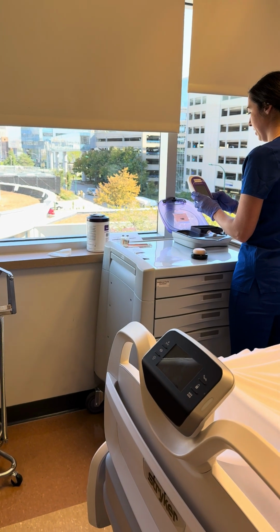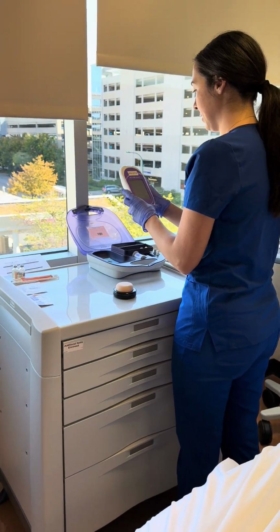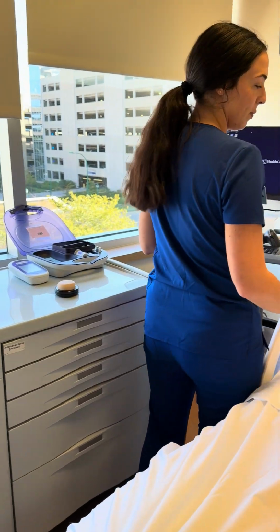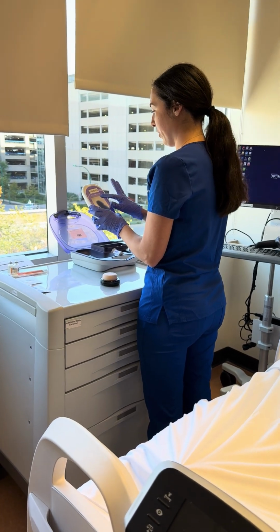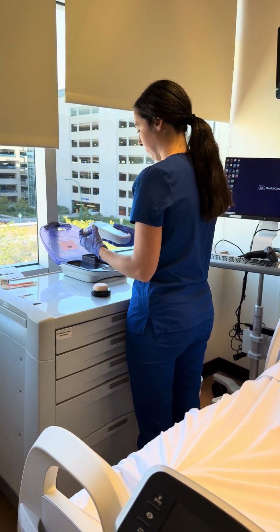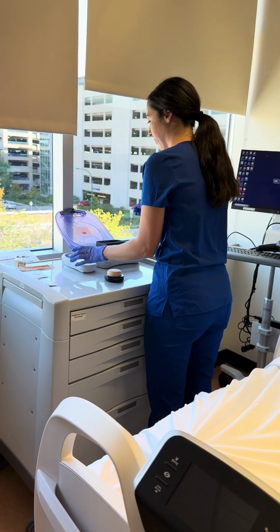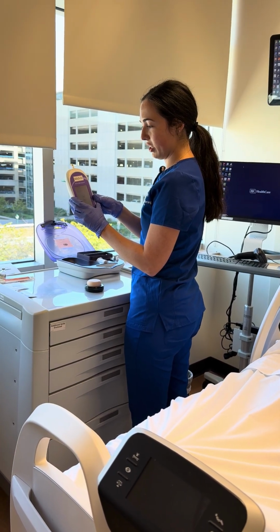Okay, we're going to go here. All right, the first thing I'm going to do is scan our operator ID. Perfect. I'm going to press Patient Test, and then scan the patient ID. Can you verify your name and date of birth for me? Perfect. All right, that's correct. We're going to press yes. Now I'm going to scan the strips here. While I wait for that to load, I'm going to grab my strip. I'm going to insert the key slot here. Make sure everything looks good.